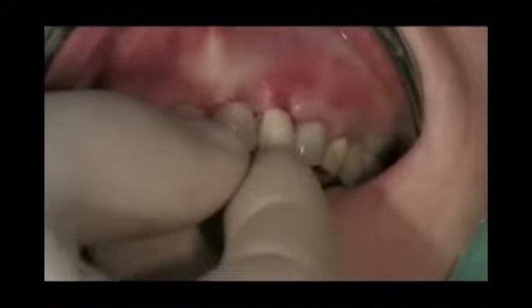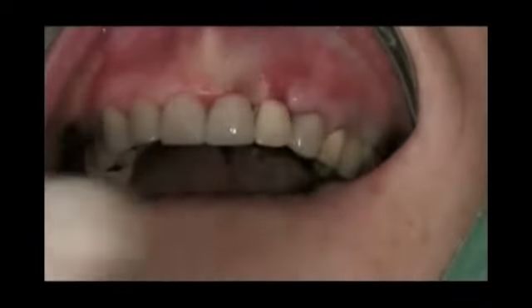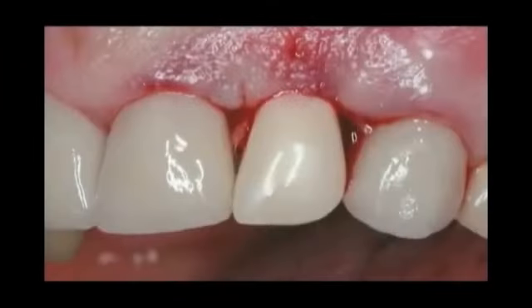The provisional restoration had no occlusal contacts in centric occlusion, following the principles of immediate non-occlusal loading. There were no contacts in lateral, working, and balancing movements. A post-insertion radiograph was taken. Since the PreFormance post is radiolucent, the implant abutment interface could not be visualized. However, the fit of the abutment to the implant was confirmed visually prior to closing the soft tissue. The patient was given oral hygiene instructions and discharged with the fixed provisional restoration in place.